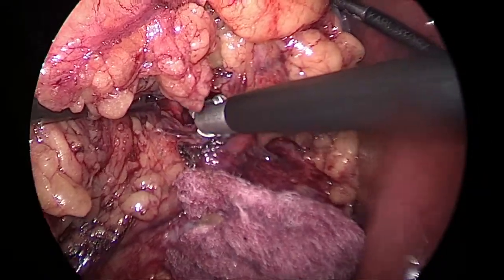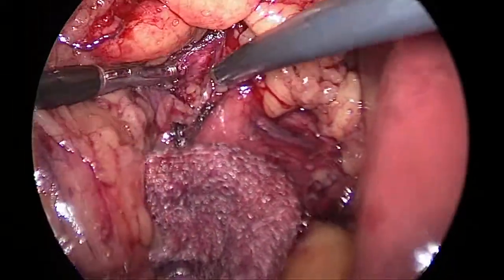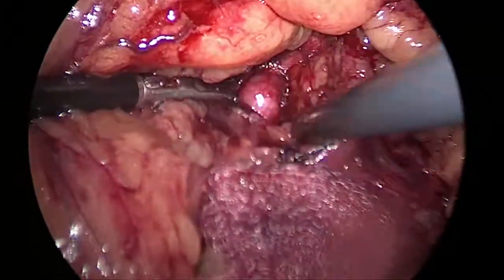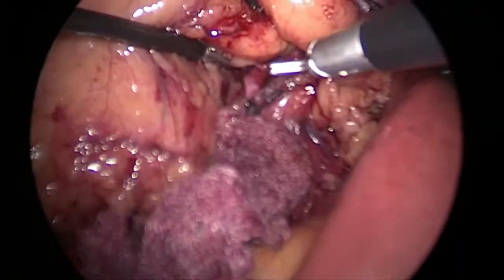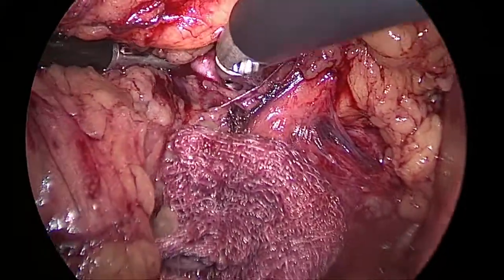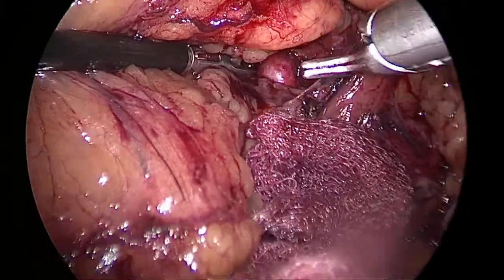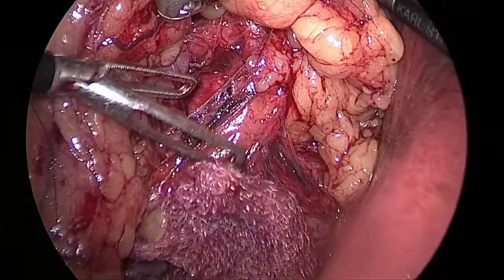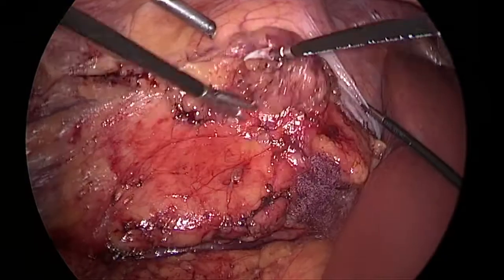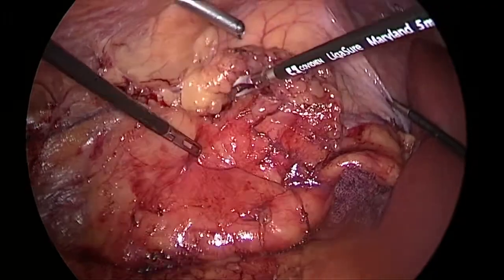At my right hand working port, I put a disposable Ethicon 10 port because it helps to put the suture materials easily inside, but my 10 forceps is not easy through this port. It is very tight. That is why I cannot work properly with the 10 instrument. It's very tight. It's gripping.